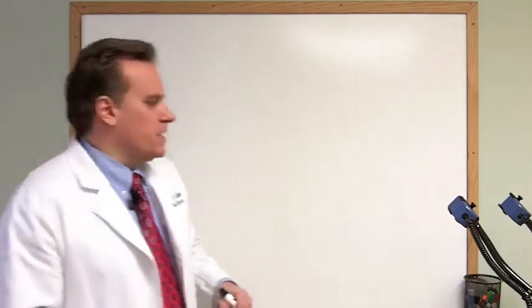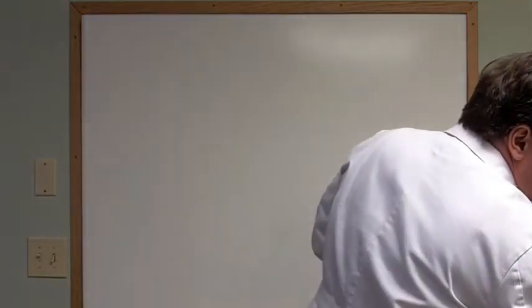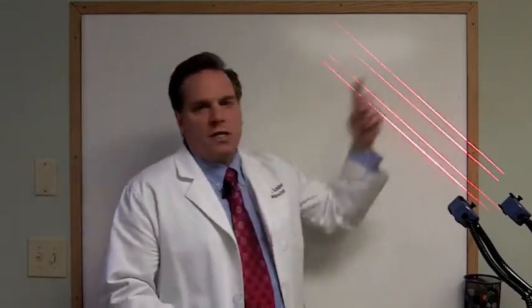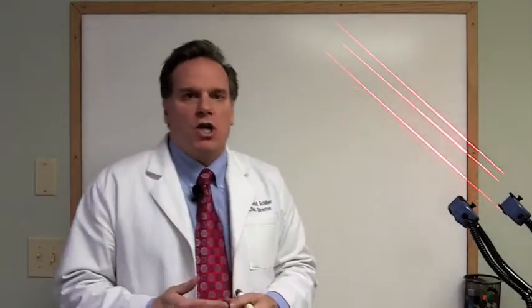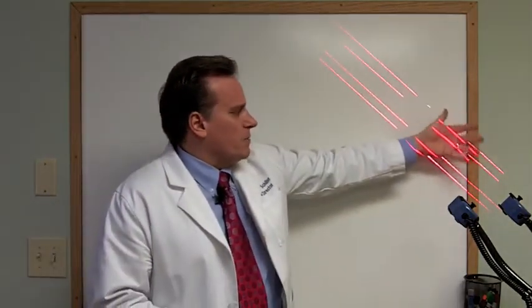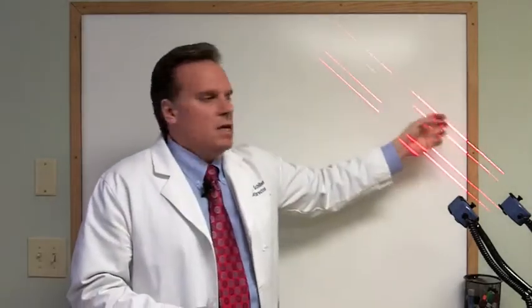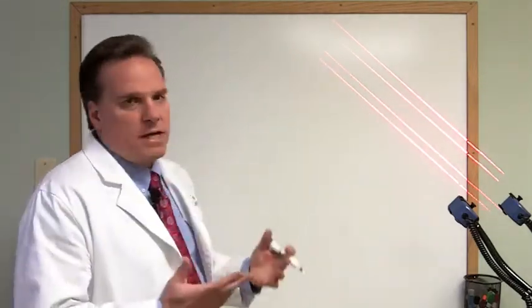So basically laser, I'm just going to turn on the laser. Hopefully you'll be able to see it on our whiteboard here. But the idea is that laser is a coherent light. It's one frequency, and in the case of what we mostly use in the office, it's either red or infrared. There's no radiation. It's harmless, although we don't do it on pregnant women. Basically, that's our one contraindication. But it can be done on kids and elderly people. There's really no contraindication to the process because it's light therapy.